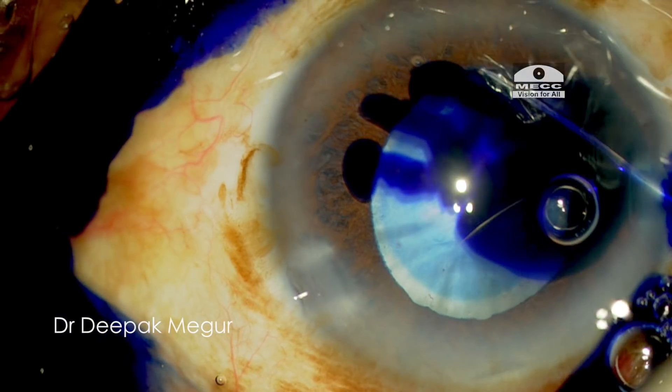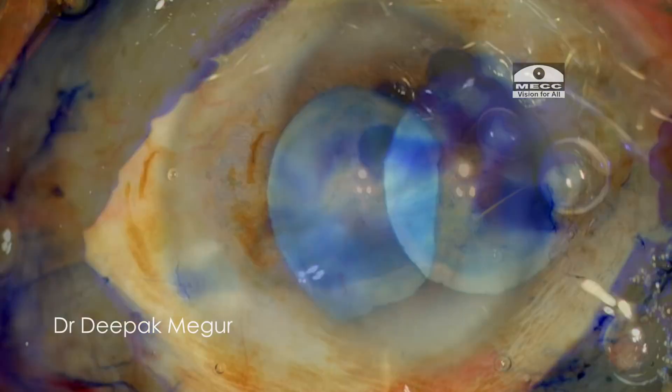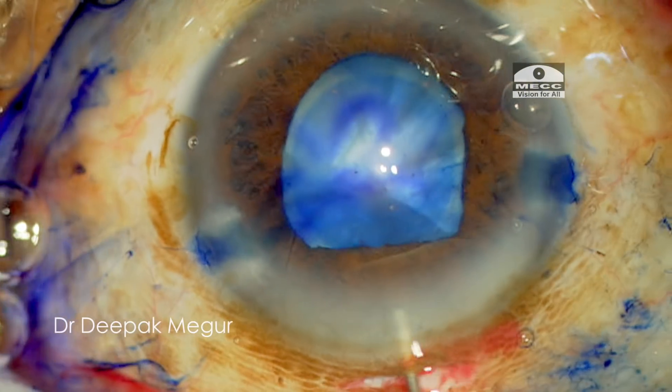I'm going to restain the capsule a little bit because the peripheral capsule is not stained that well.